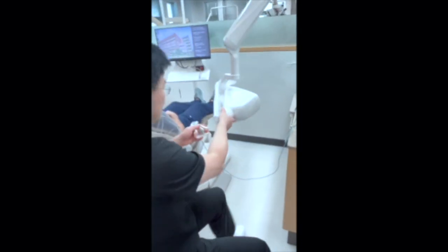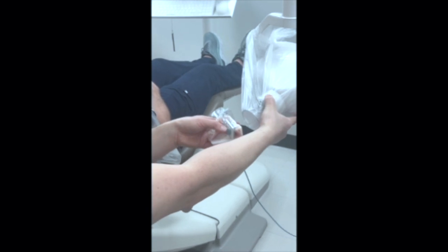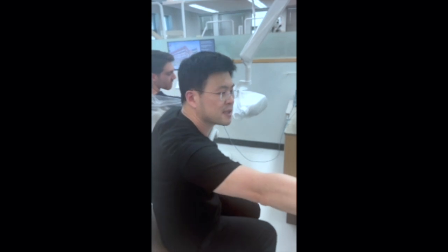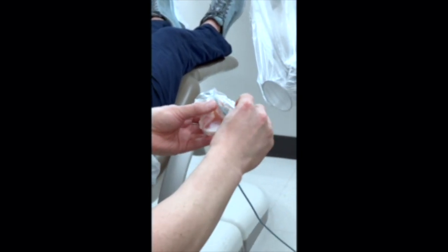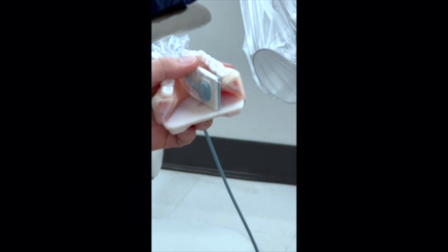Once you have it placed, you want to have the x-ray tube already ready in the location. Make sure it's in the area where you're taking the radiograph. Allow the patient to hold the sensor with the Crawford stick holder. But even within 5-10 seconds, you'll see the sensor will almost always inevitably go up. So it's important to make sure you have everything ready, the switch next to you, and once you press the button, that everything will be captured.